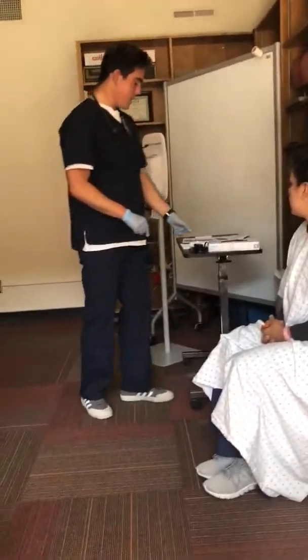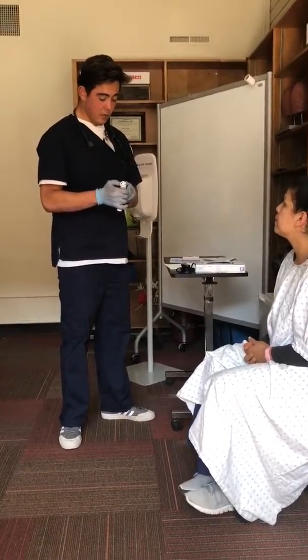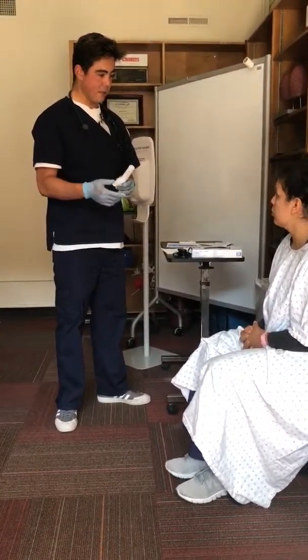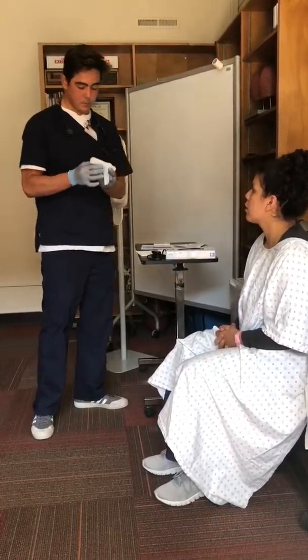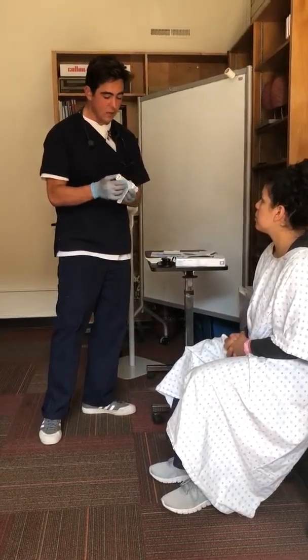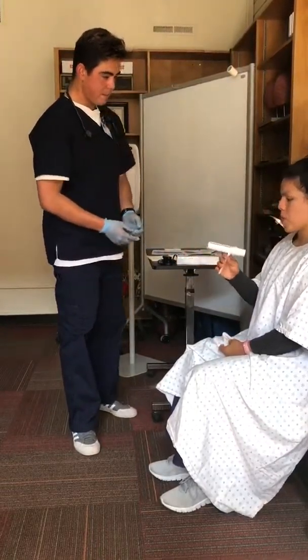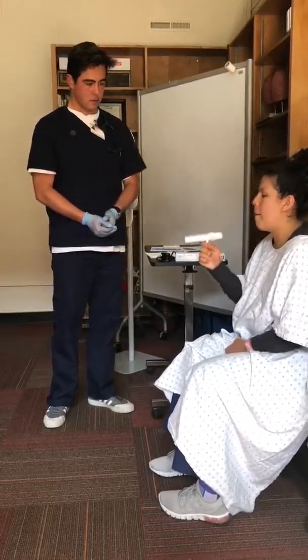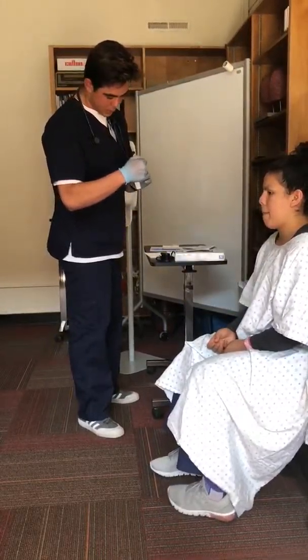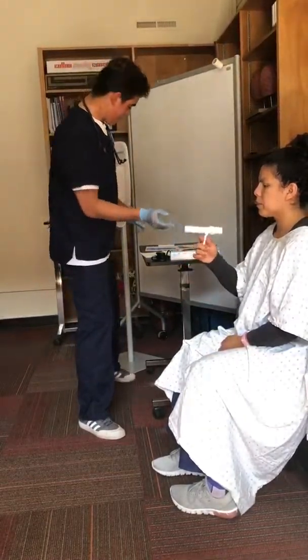Okay, so after this we're going to go ahead and do the peak flow one more time, okay? Same thing, we're going to do 3 tests, and we're going to take the best and compare it, okay? So hopefully you improve, you're able to blow a little bit more. So again, our target's going to be 418, okay? So feet on the ground, shoulders back still. Good job. So we're at 400. Okay, I'll go ahead and record that.